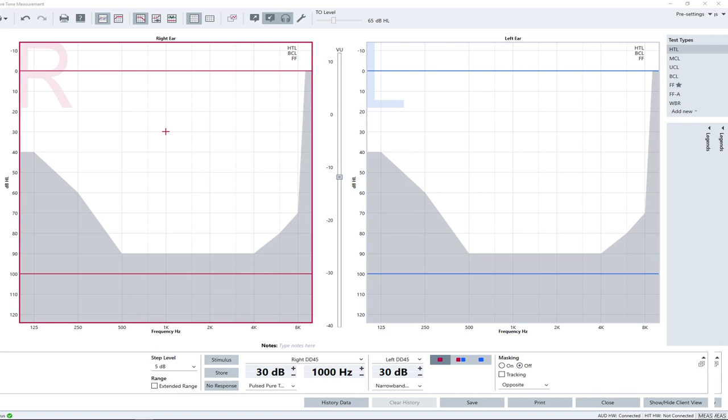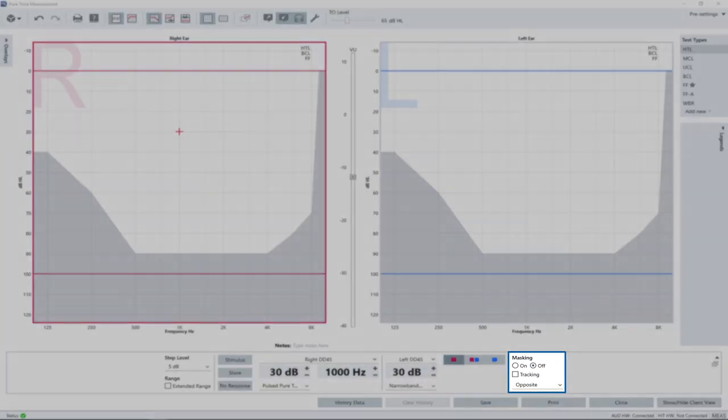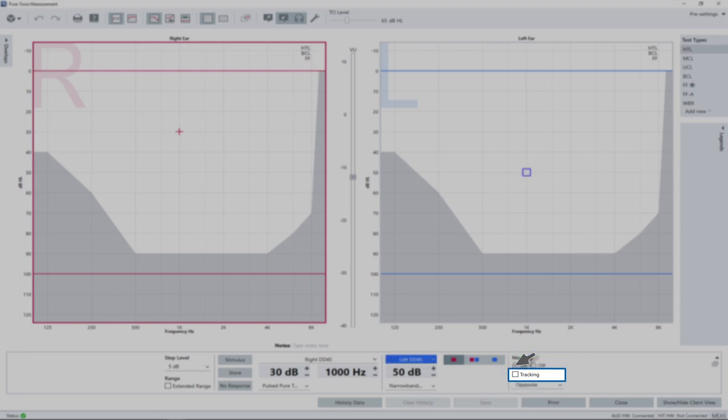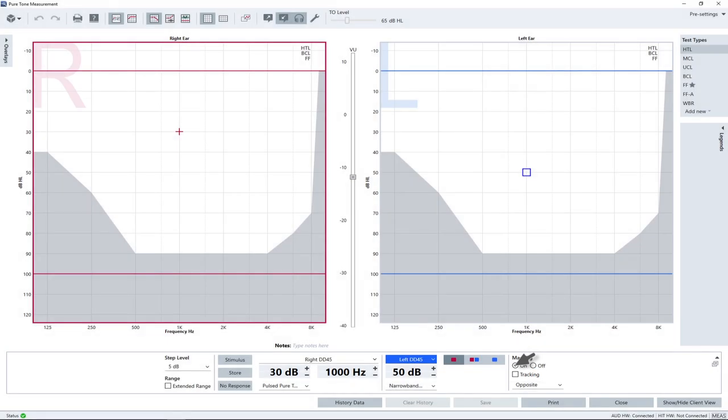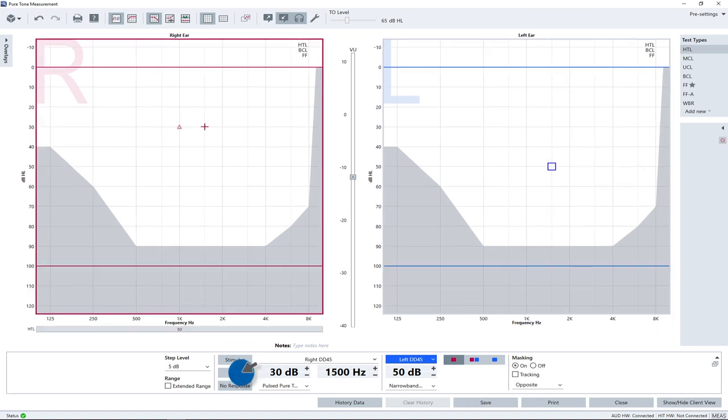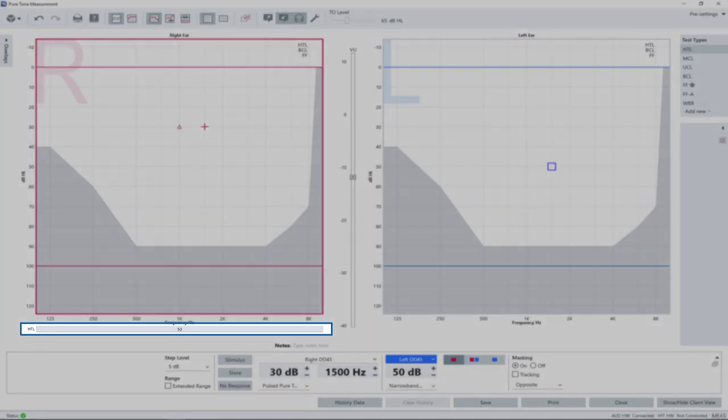If masking of the opposite ear is necessary, activate masking from the control panel. Set the masking level in the control panel. Optionally, activate the level tracking checkbox to maintain the signal and the masking level ratio unchanged during signal level adjustments. After storing of the threshold, the masking level is displayed below the audiogram.